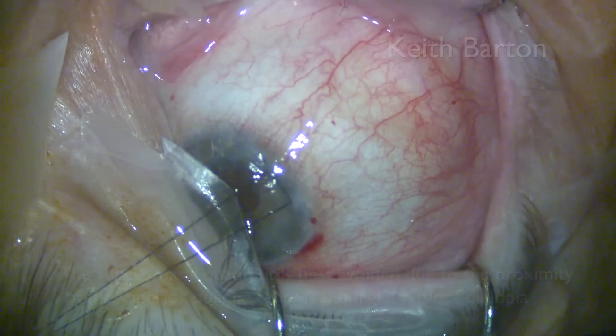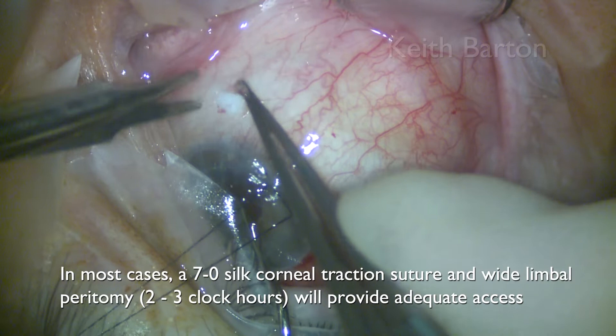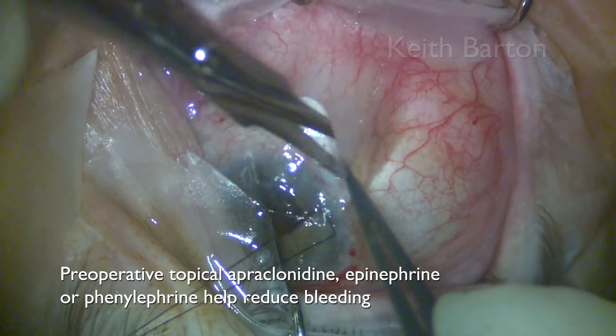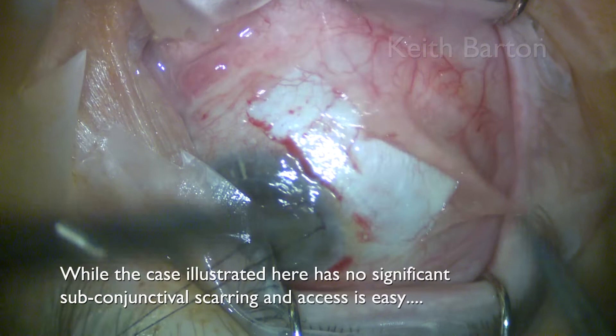In most cases a 7-0 silk corneal traction suture and wide limbal peritomy will provide adequate access. Preoperative topical apraclonidine, epinephrine, or phenylephrine can help reduce bleeding. While the case illustrated here has no significant subconjunctival scarring and access is easy.